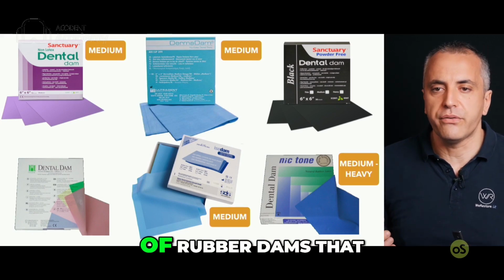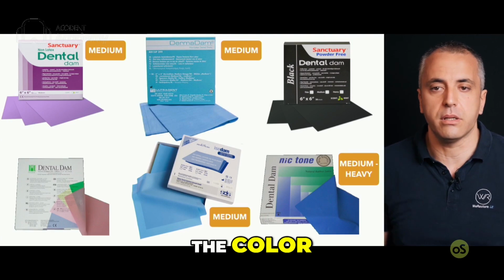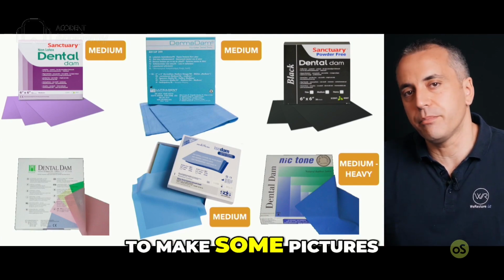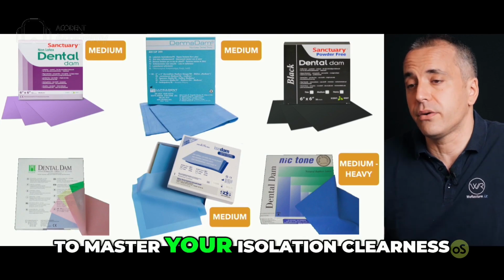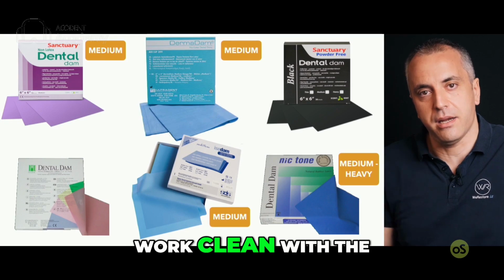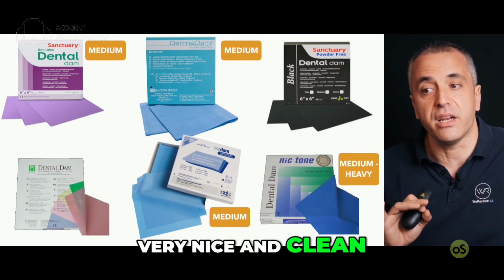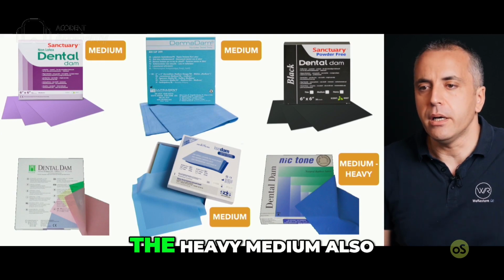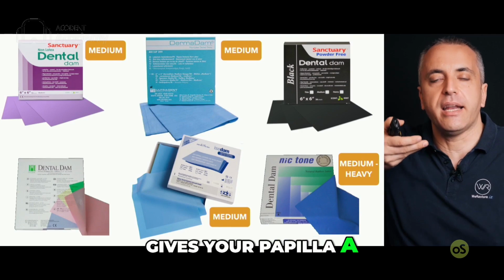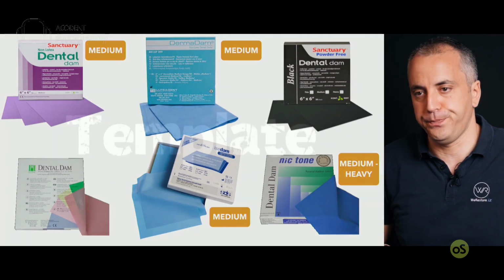We have some types of rubber dam that are based on, for example, the color. It's wonderful, the pink, the black. The black is nice to make some pictures, but it's also nice to master your isolation cleanness, because if you can work clean with a black rubber dam, you are very skilled in working in a very nice and clean operatory field. The heavy medium also gives your papilla a nice retraction, so you can show more cervical parts.